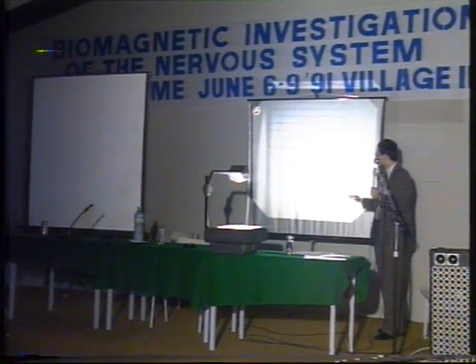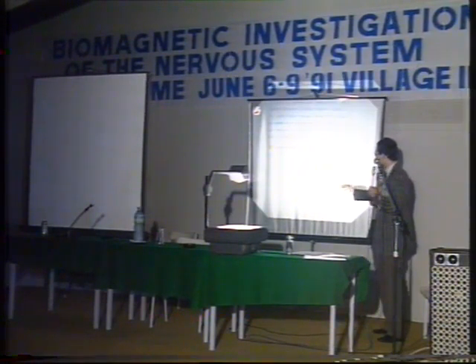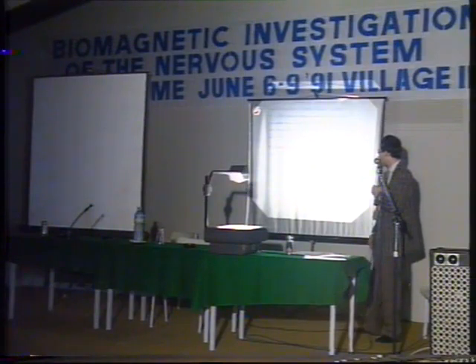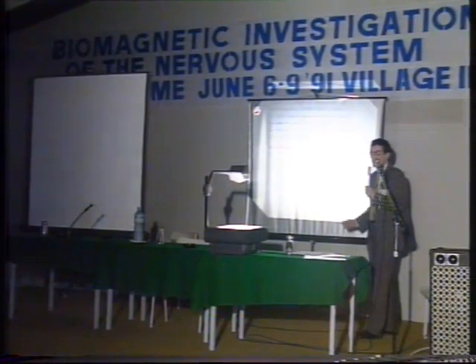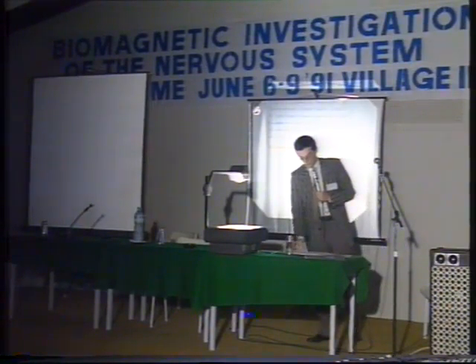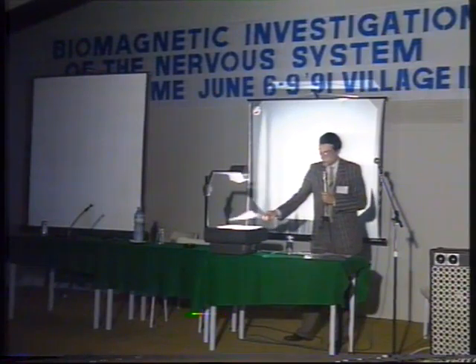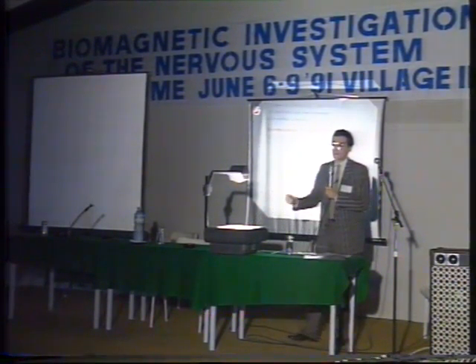Usually we had 8 to 9 successive positionings, in one case 10, but anyway from 72 to 81 scalp sites. And the total recording time was about 2 hours, 2 and a half hours on special cases. I mean the whole session, going from patient preparation to the end.